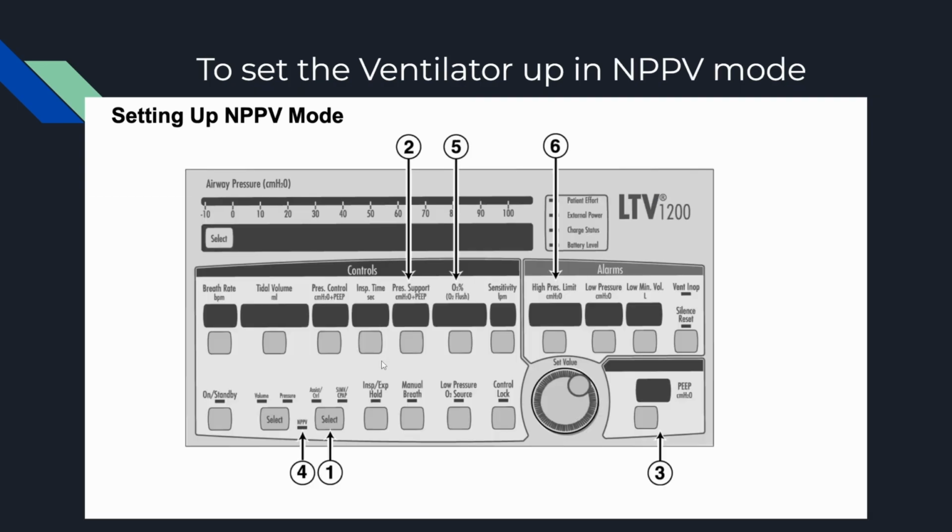Okay. Then we've got NPPV mode. This is the part of this vent that most people mess up.